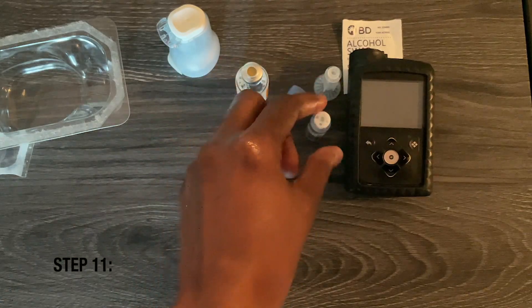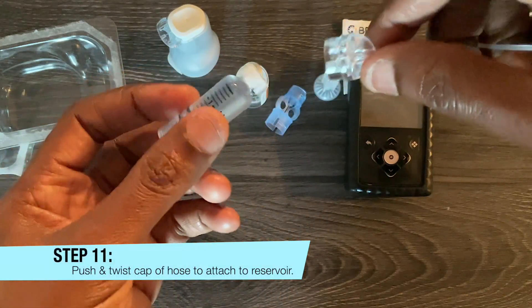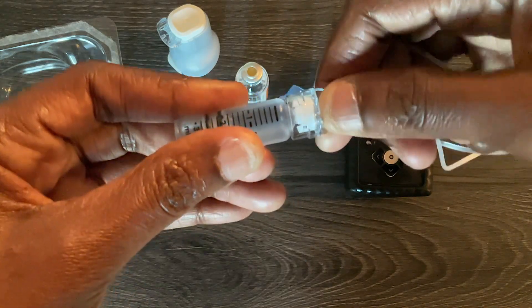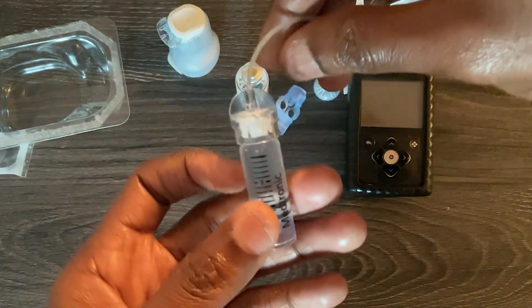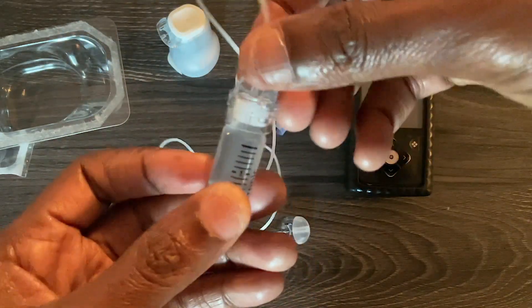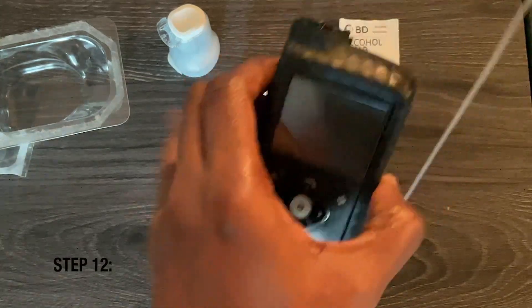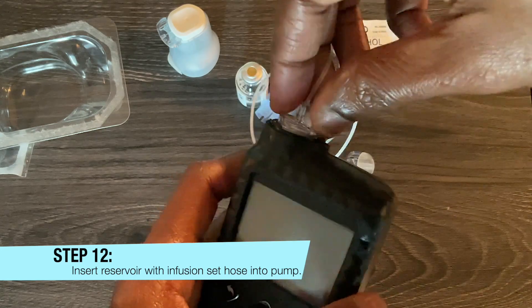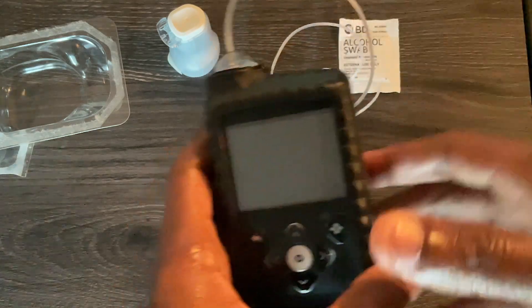Take the reservoir — not the vial, the reservoir — and take the cap and twist it onto the insulin reservoir to secure it. Now take the pump, insert the reservoir, and twist it in place.